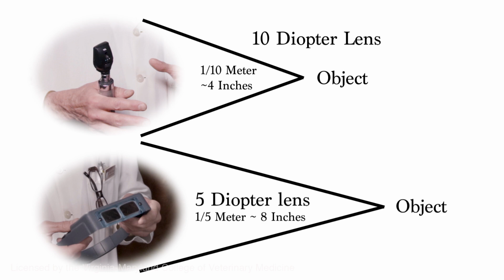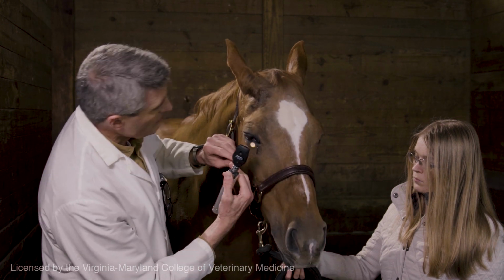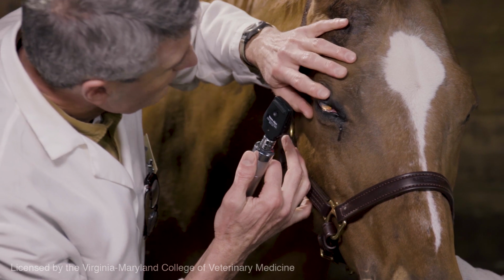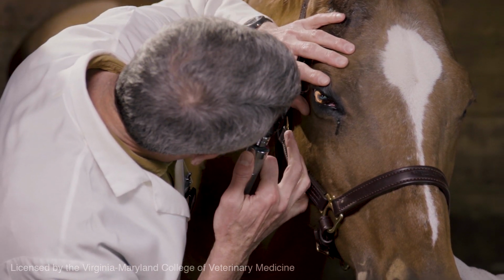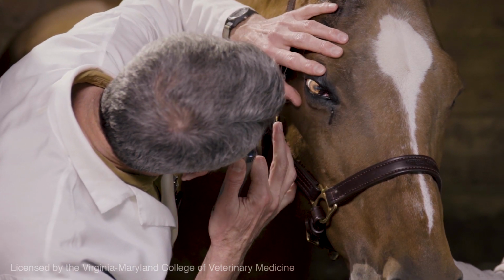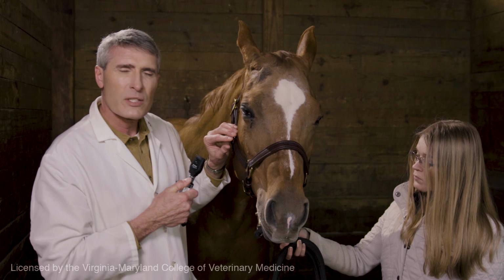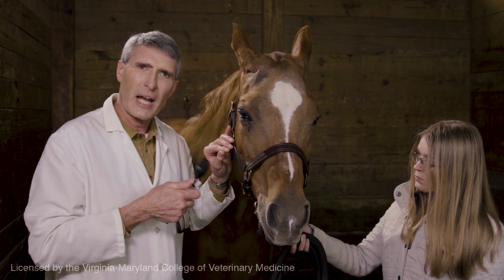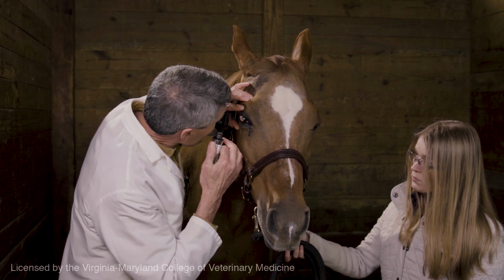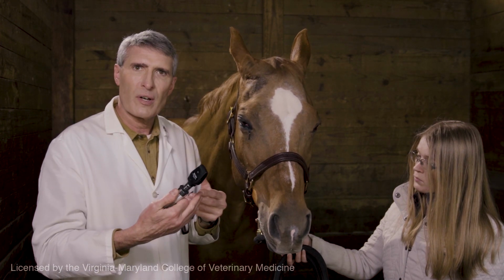So if I wanted to look at the surface of the eye from 4 inches away, basically I put my hand on the halter, gently raise the lids and look through, and I can focus. I have a little dust in the tear film here, but I can focus from 4 inches looking at the surface of the eye. If I want to look at structures deeper into the eye, like the iris, I simply move forward. And now the iris will be in focus because it's a little bit further away from me.